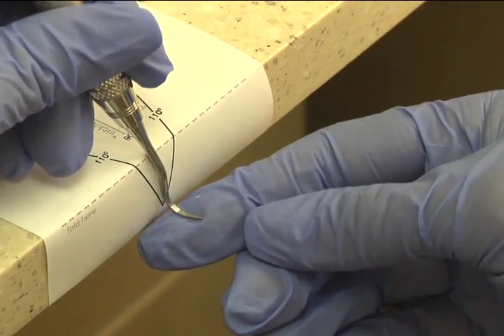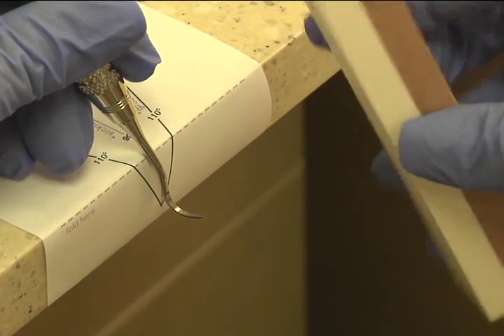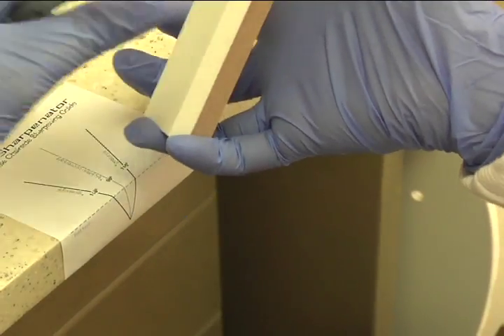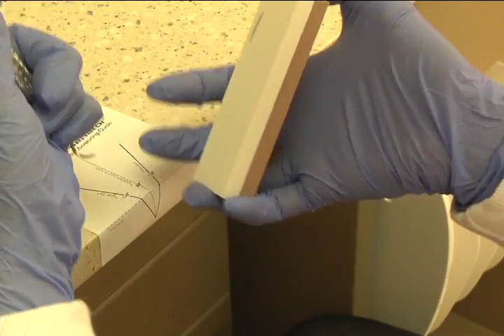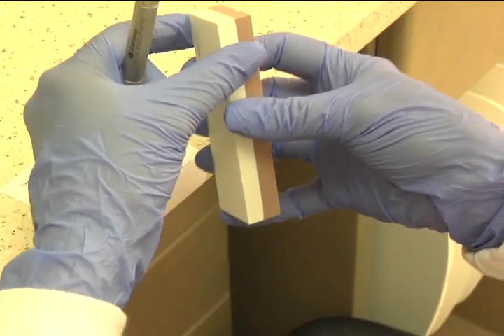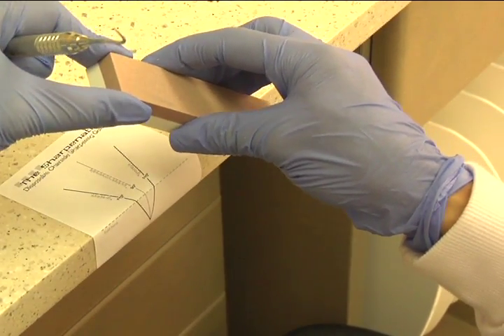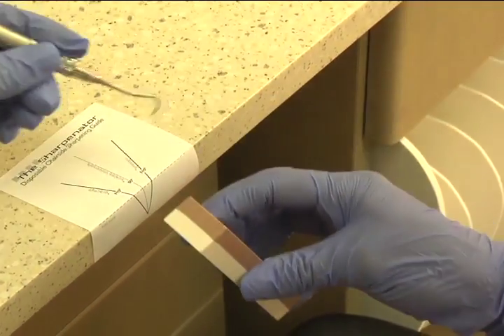So now we will do the other side. And I'm holding the stone the same way. I've seen a lot of people try to hold the stone like this, and if you could, try to break that habit, because once you do it like this, you're not applying equal pressure to the stone, and also you can ruin the toe of your instrument and you have a hard time manipulating the stone around the toe. So it's a good idea just to have your thumb on one side, your fingers on the other, and you're holding it so that there's still a third of the stone that's free. You're not up here like this, you're holding it down just a little bit.